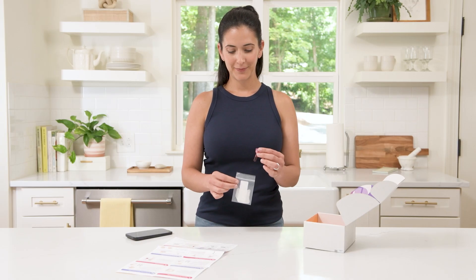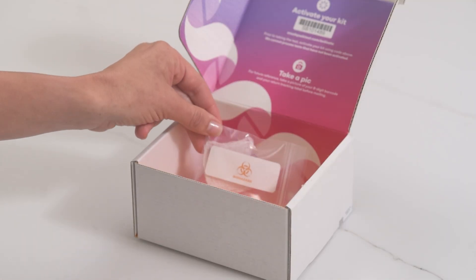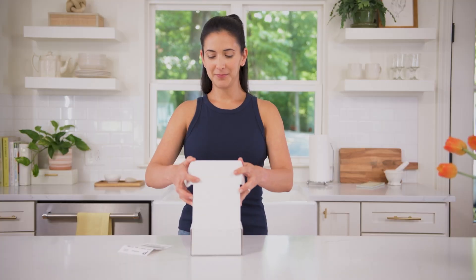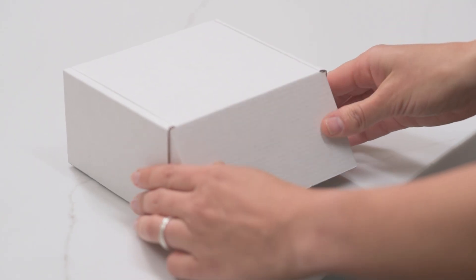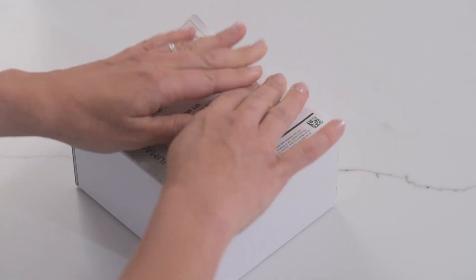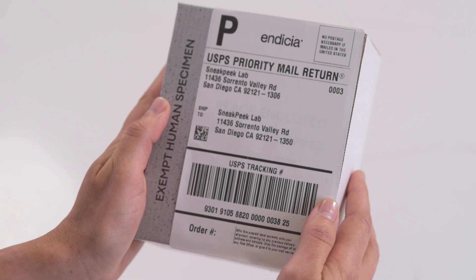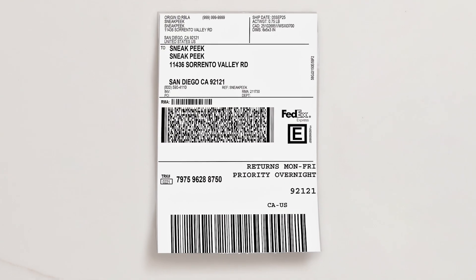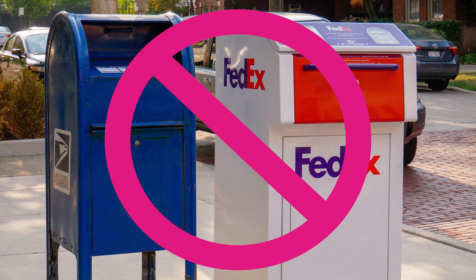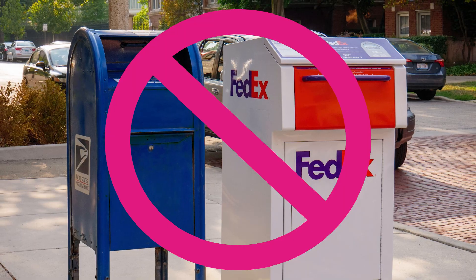Put the tube into the small biohazard bag with the gauze still inside and seal it. Place the bag into your Sneak Peek box, pull the adhesive from the lid of the box, and seal. Find your prepaid return label, affix it to the back of the box, and mail. Check the label to see where to drop it off — if it says USPS, go to a post office; if it says FedEx, head to a FedEx shipping center. We don't recommend outdoor drop boxes, as pickups can be delayed and extreme temperatures might affect the quality of your sample.